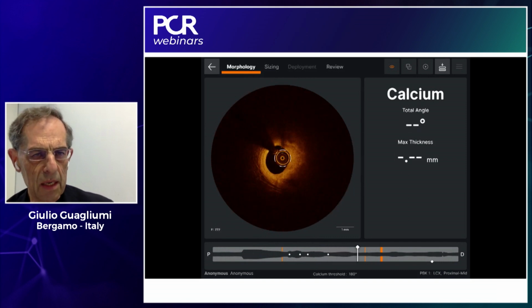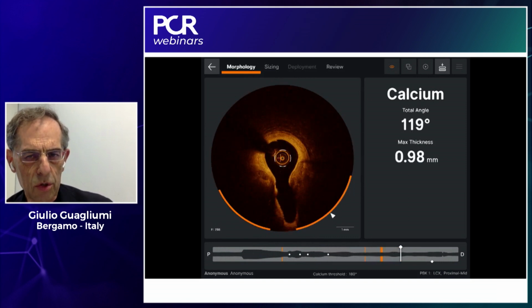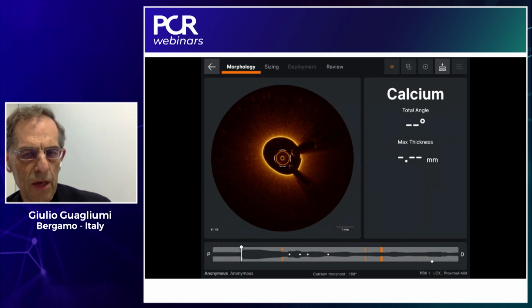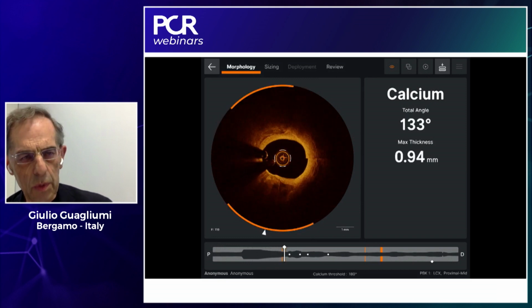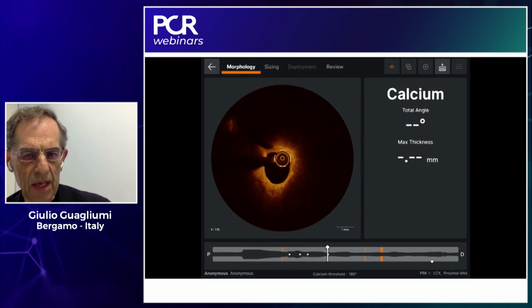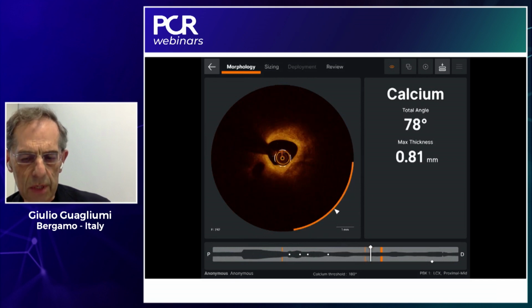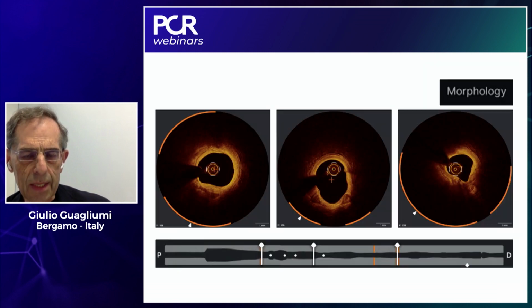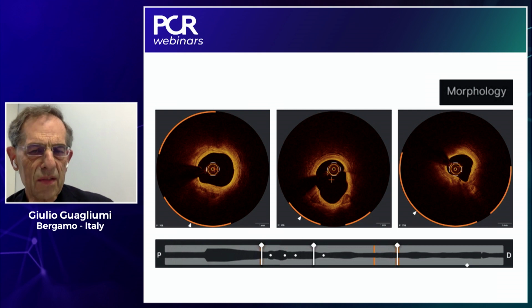Here you can see the display is quite different compared to the usual one, and is going step by step. It has been shown the value of detecting the content, what we call morphology. Here you have the run with the morphology. So as a first step, we wanted to know about the content. And this is a slide showing 3 freeze frames of what you get in the circ at different points. Let me make this clear.